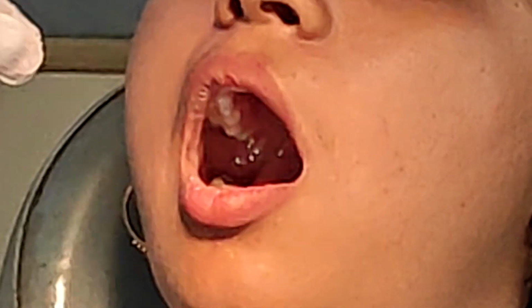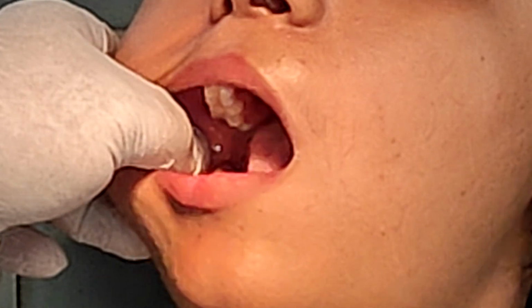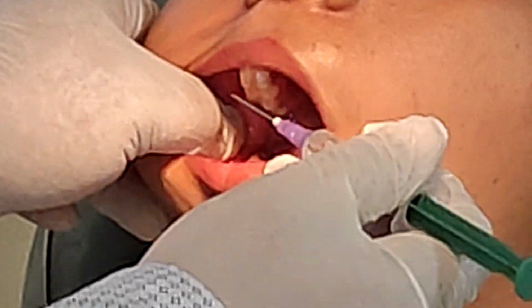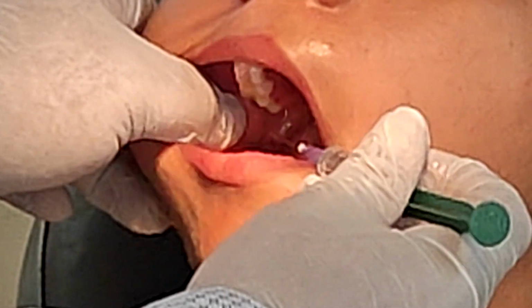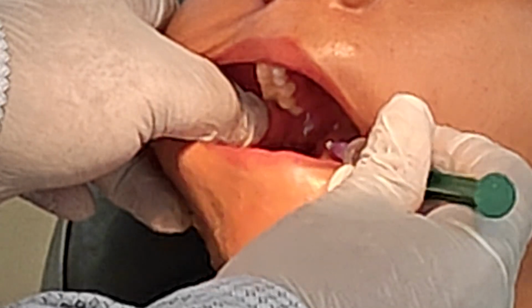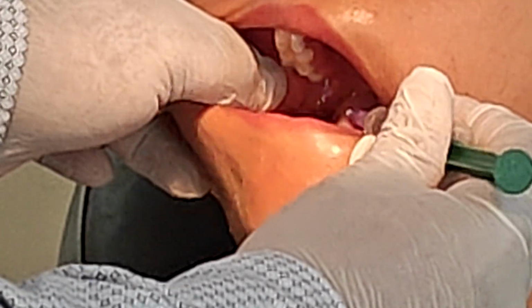We'll show. We'll use a needle of around 25 to 27 gauge syringe, in which we'll follow all the landmarks. The positioning of the syringe is in such a way that the needle should get inserted in the pterygomandibular space approximately 6 to 8 mm above the occlusal surface.